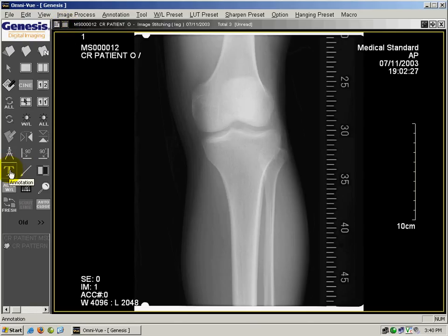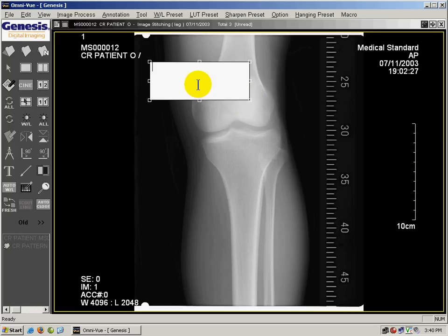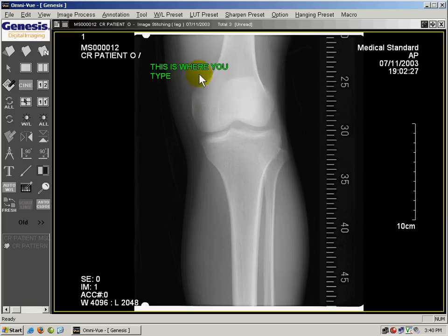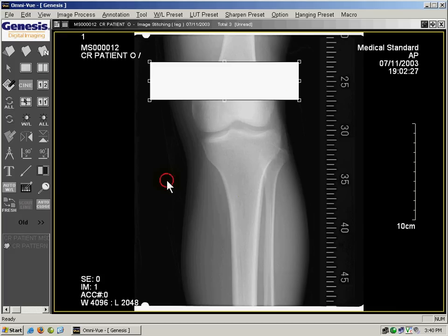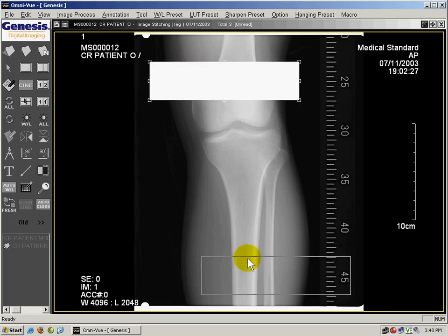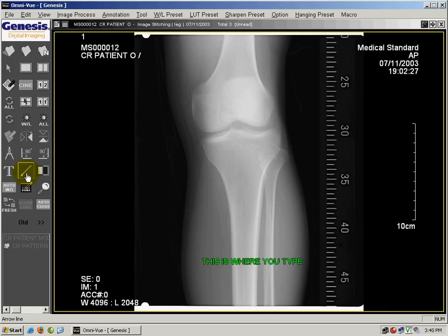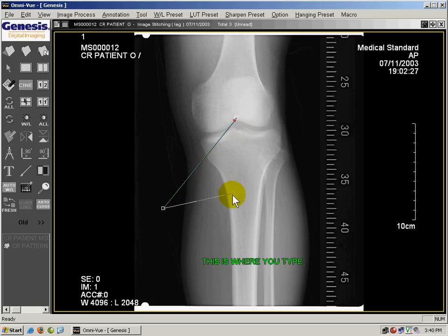I'm going to add an annotation to this image by clicking on the T. You'll have a cursor, and you're going to click and drag out a box for you to type in. When I'm done, I'll click off the screen — click in the area outside of the box — and it will add that annotation. You can modify it by dragging the box to change the size or dragging it around. You can also use an arrow to highlight an area of interest and click on the ends to move the arrow around.